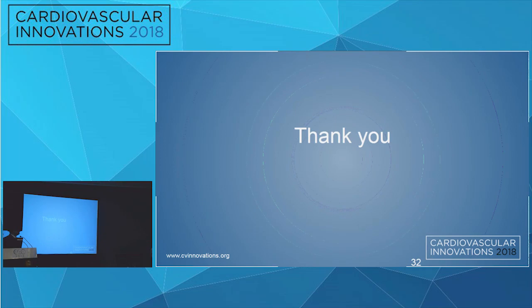Very good. I had one case just like this in a young patient, a 30-year-old with scleroderma CREST syndrome. She had totally clean arteries, no atherosclerosis anywhere else, just a focal LAD lesion. And we ended up stenting it just like you did.